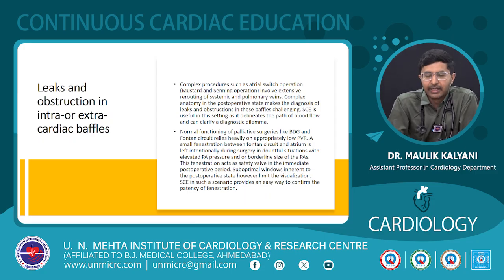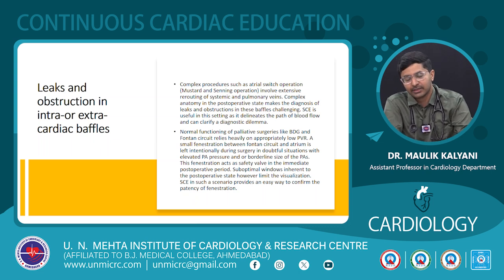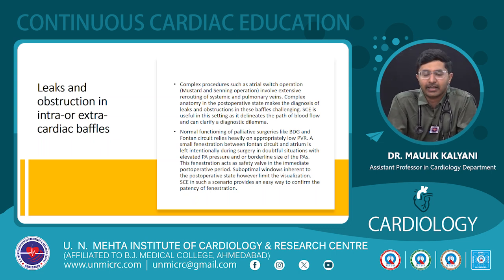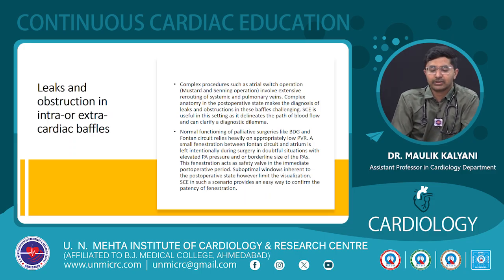So in these cases where an atrial switch has been performed and many times it is not possible to tell whether it is working or not, we can go by this. Normal functioning of palliative surgeries like the bidirectional Glenn and the Fontan relies heavily on appropriately low PVR. So many times when the PVR is high or borderline, we may leave a small fenestration so it can cause decompression.